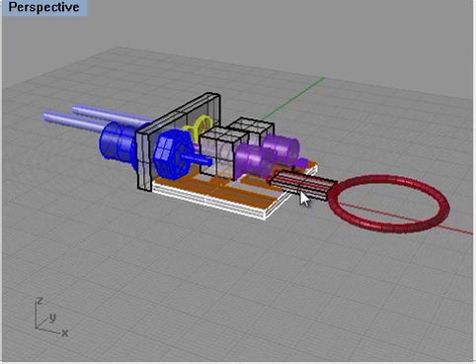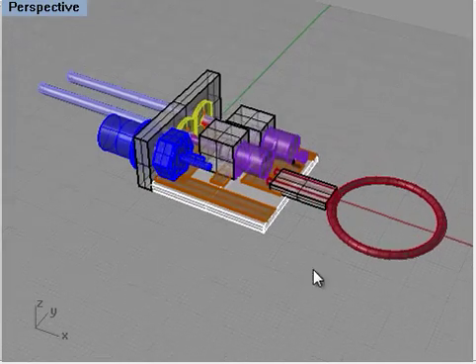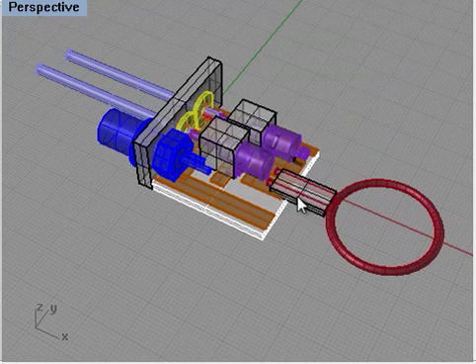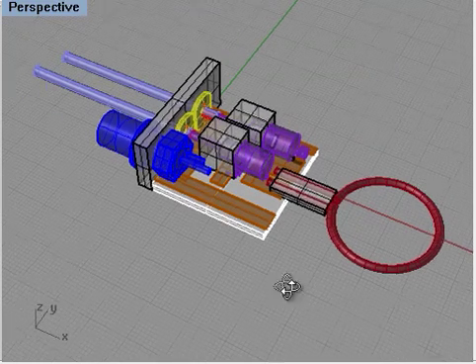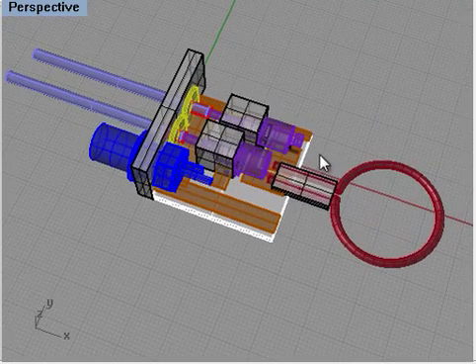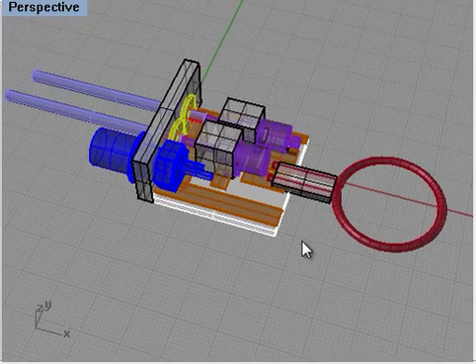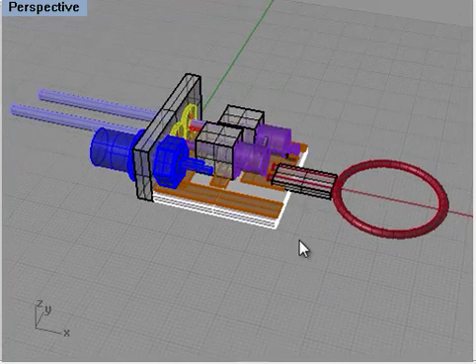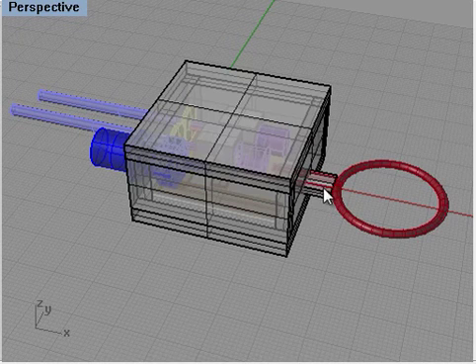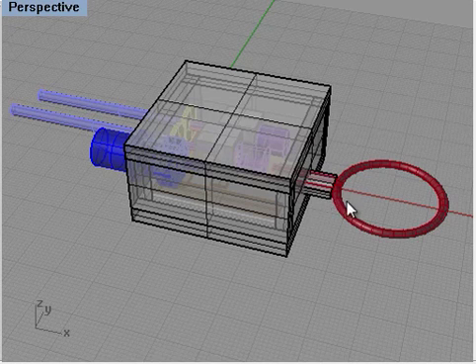But one issue with these legs is that they don't add anything, they really just take away from the quality of the image. So if you're going to design a circuit like this, it's important to keep these legs as short as possible. And this little block of plastic here is just a support structure, so that when this is on, the coil isn't easily bent up and down.